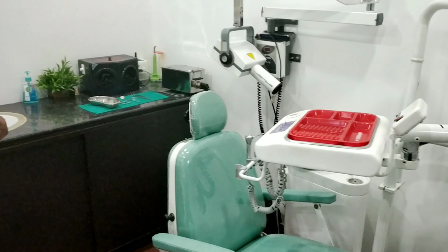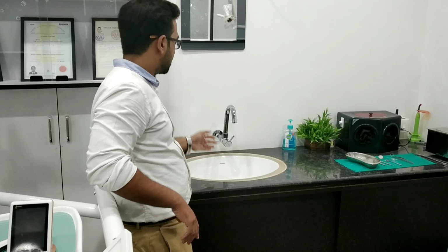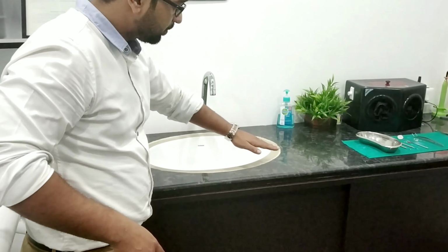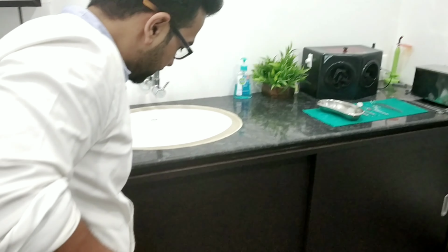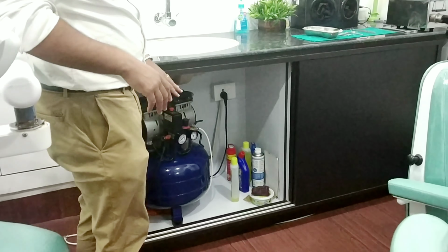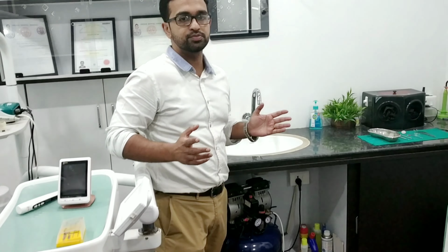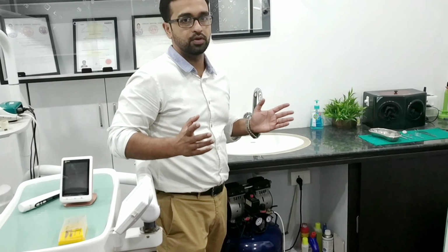And this is my working area where I do all the lab associated works. And this is the basin which is incorporated into the slab area only. And this is the cupboard where I keep my compressor. So if you keep your compressor in an enclosed cabin, it will not produce much sound. And this side is the compressor and all washing things are kept here.